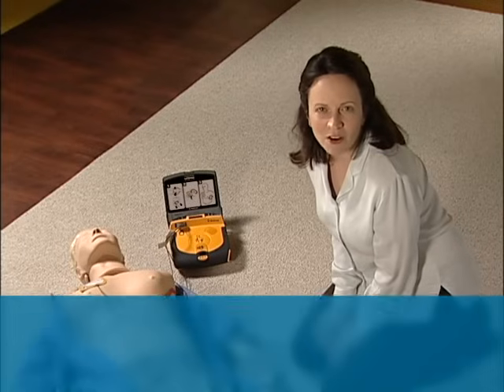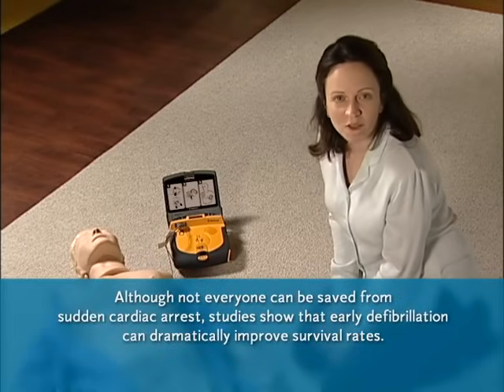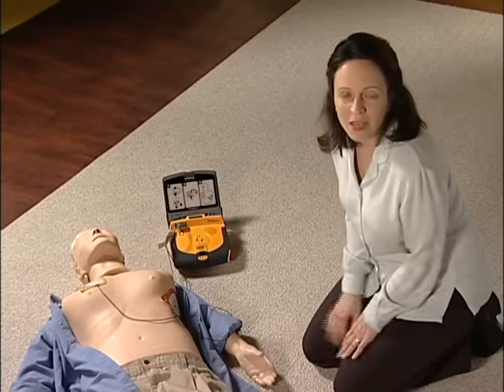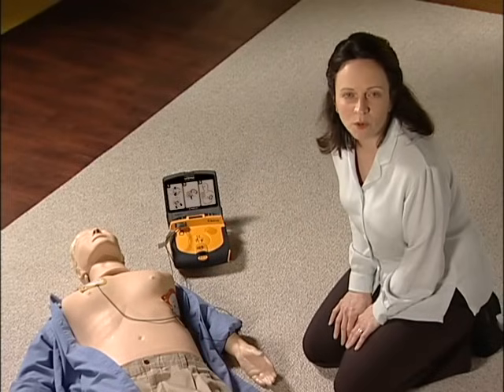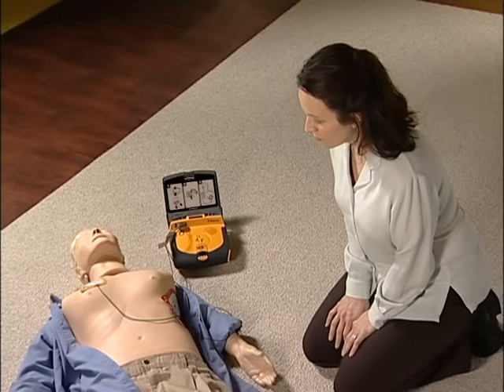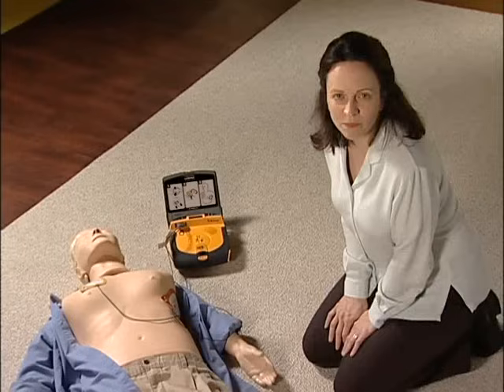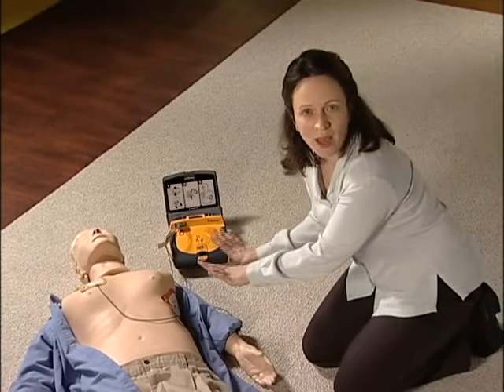While you're doing CPR, the LifePak AED will interrupt you at intervals so it can check if another shock is necessary. Do not touch patient. Evaluating heart rhythm. Keep staying clear of the patient while the LifePak AED is reevaluating. It might decide to shock again, or it might say, No shock advised. Provide chest compressions and rescue breaths. Even if they start to move or breathe normally, don't take the pads off.